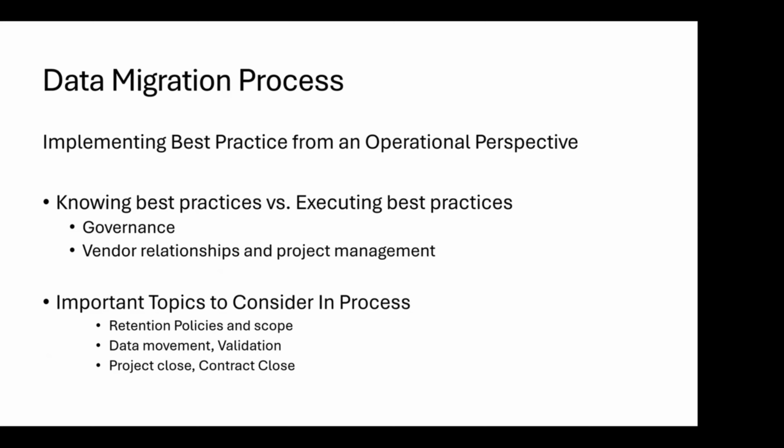So in this example, imagine you have a bunch of legacy PACS systems that have been around and have data that might be 10 years old or even older. And your retention policies for your organization say that you need to keep data for 7 years, and then for PEDS, 23 years. I'm just throwing those out there; we use something like that at Maryland, but that's an example. When you have those policies, then it's not a question.